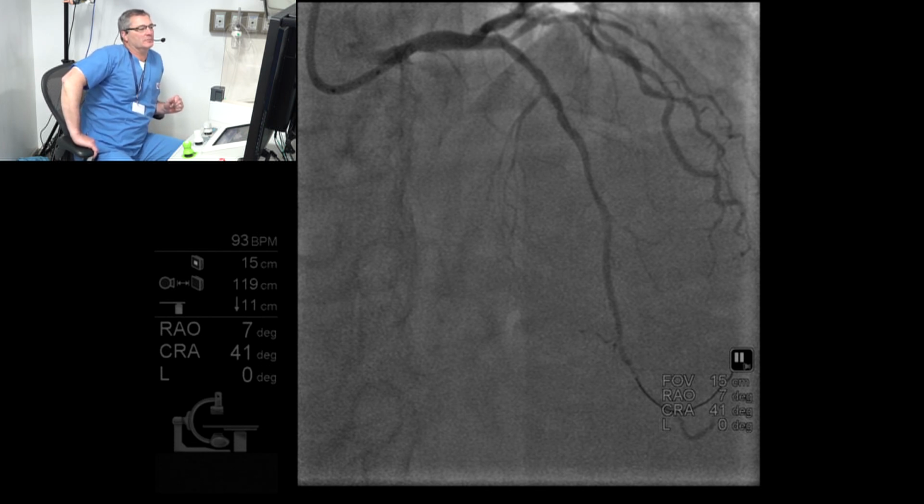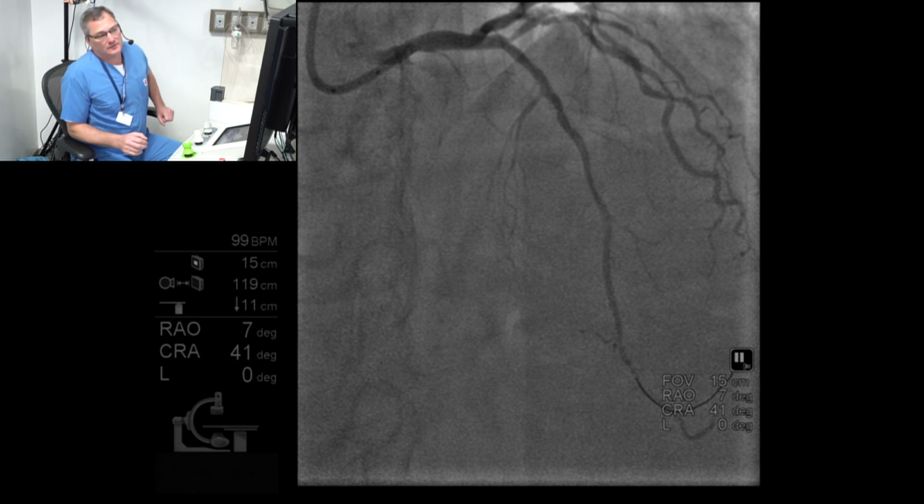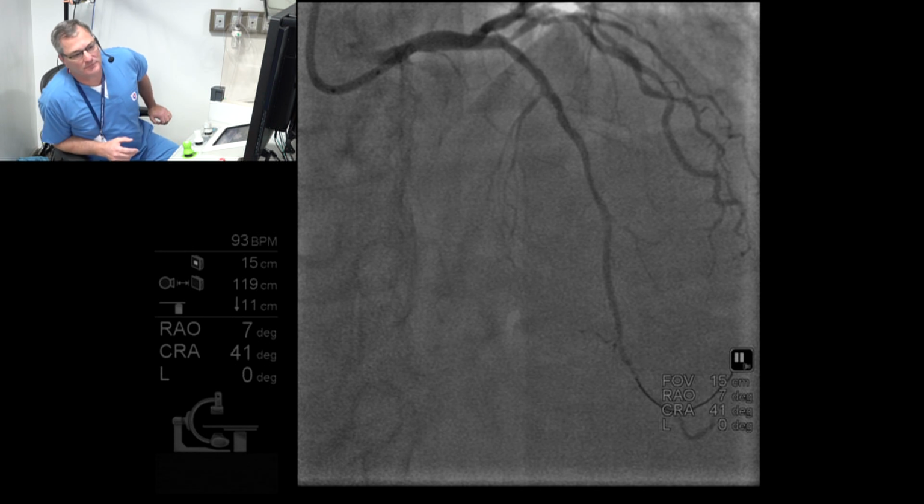So we'll put this one beyond the diagonal as far as it goes, and then we'll take another stent. We can actually probably measure with this stent balloon, so we can figure out exactly what we need. You just ask him, 28 or 38? 28 is fine, but we're going to need another. This stent is 38, he has kept. Is it open? It is open.